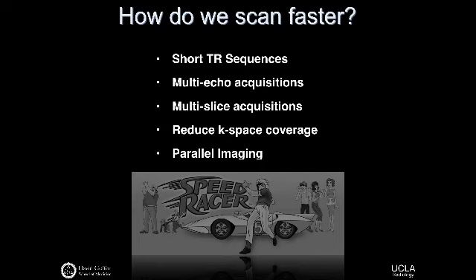So SNR is a challenge for us, right? And MR, as we've sort of indicated already, is relatively slow. So what I want to talk about in the next 6 or 7 blocks is ways in MR that we can actually scan faster, and some of the really routine and common tricks we use to scan faster. So categorically, these are the different ways.